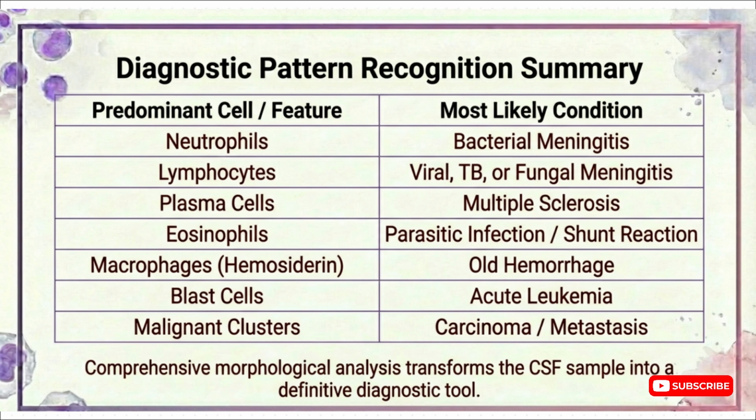And this, right here, is the incredible power of morphology. It transforms a simple fluid sample into a window, giving us a direct, unfiltered view into the health of the central nervous system.